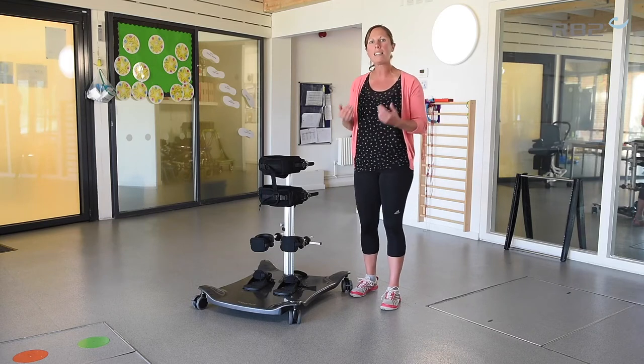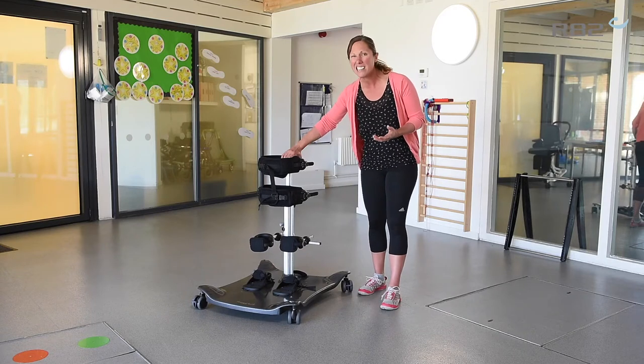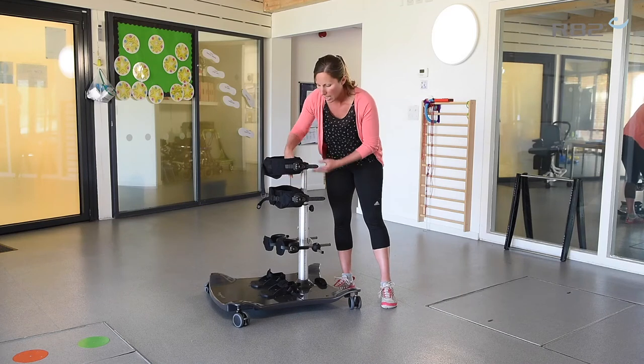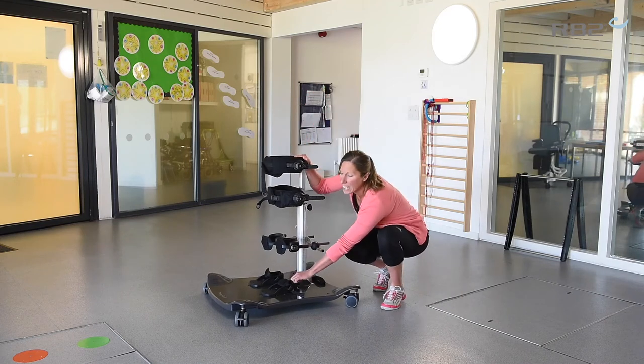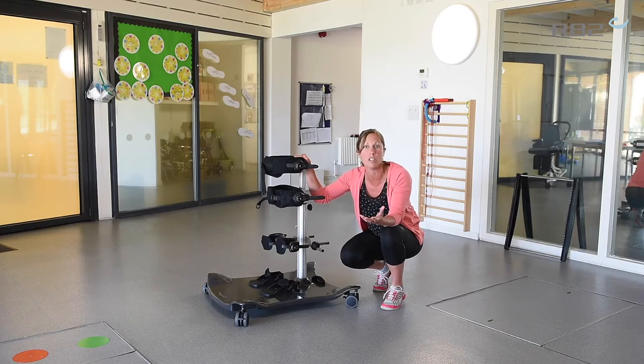You might look at a more anterior position if the child is more new to upright standing, or perhaps needs a bit more support. Because in that anterior position you've got the firm support here at the front. You can also quite easily change the foot plates around from anterior to posterior, so it's quite easy to change between the two positions.